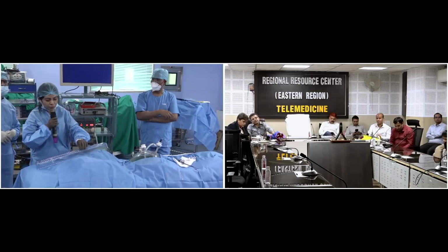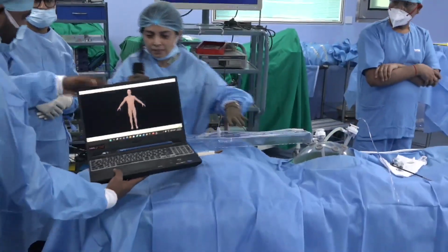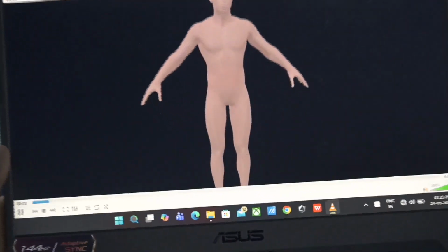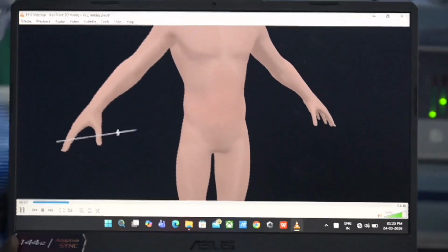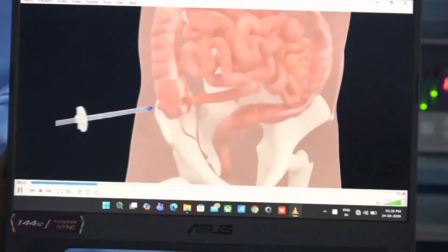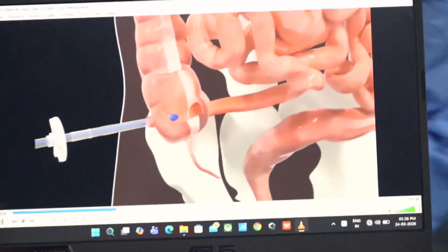So there is one more thing that I would like to show you today. Can we focus on this laptop presentation? No, let us just have it focused first. After a low colorectal anastomosis, we do an ileostomy. Now we have something with which we can avoid doing an ileostomy and just do this. So this way we will be able to avoid another surgery for the patient.